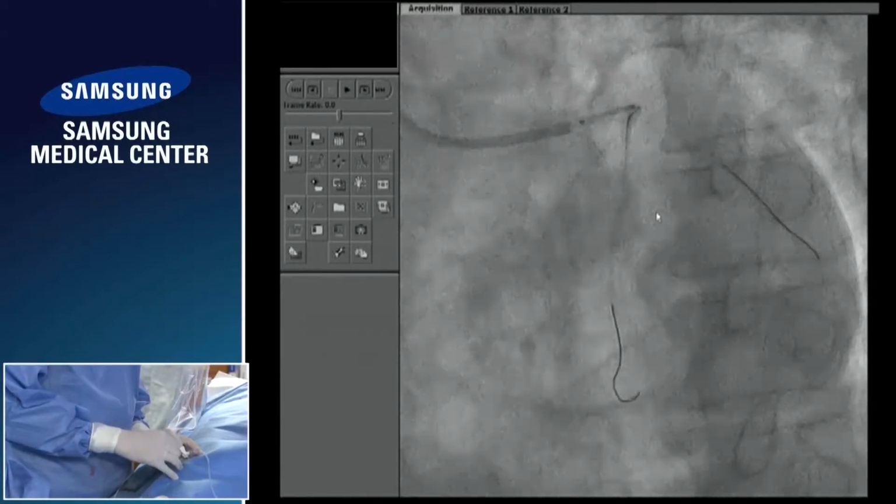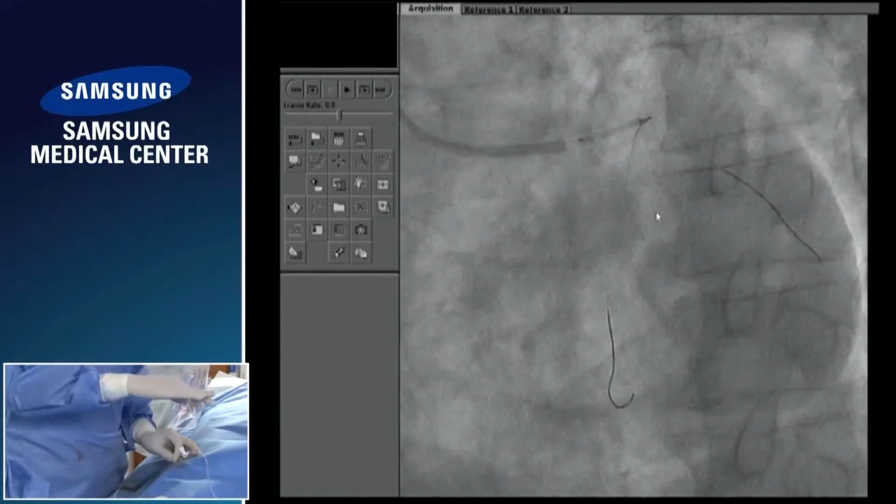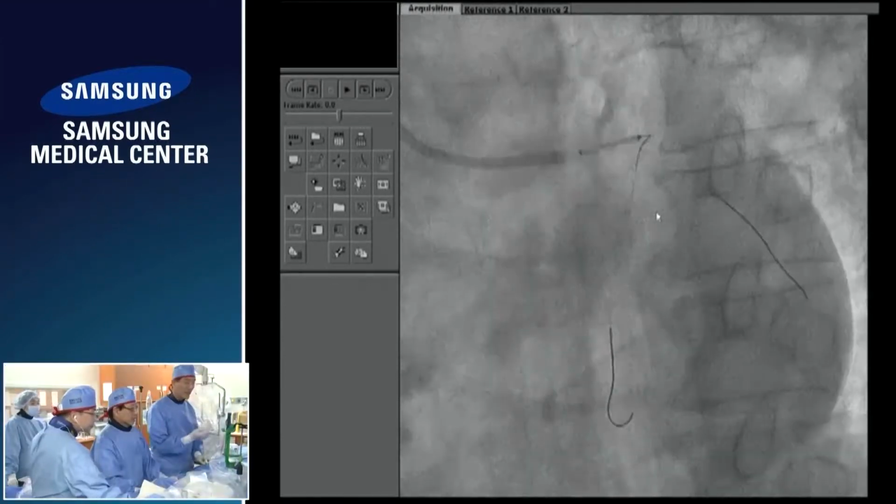Okay. Best position is the halfway above the lower portion and the inside of a higher portion.